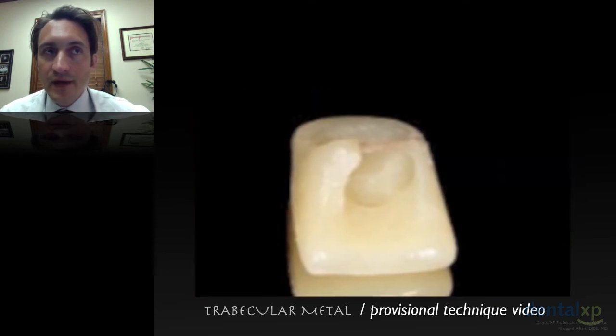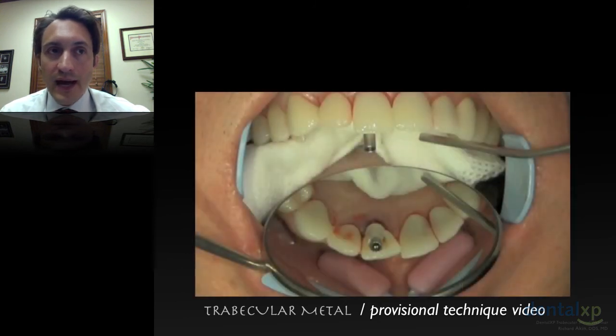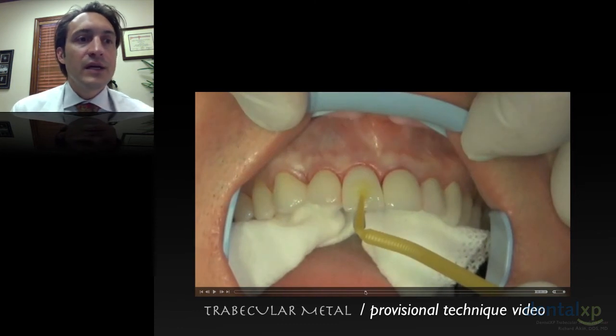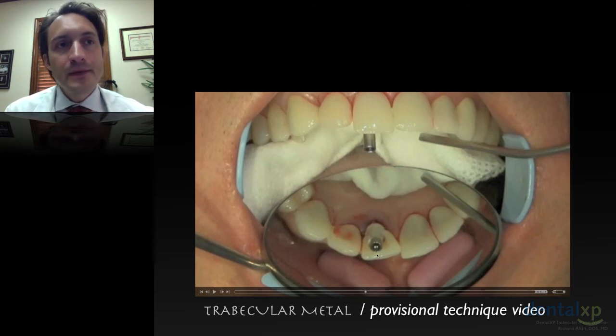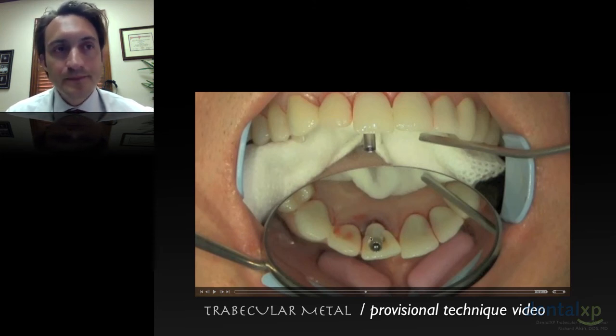And here is the view. It basically has wings on it, and I'll cut it out, and I'll just show you, since we didn't talk about this earlier, I'll show you this briefly. The wings are here, and in this case you can cut this off completely and use it almost as a veneer. I find if the wings are in place, it kind of begins the circle of the flowable composite and will help index this a little bit better if you can do it.